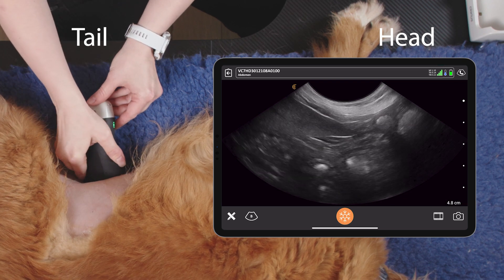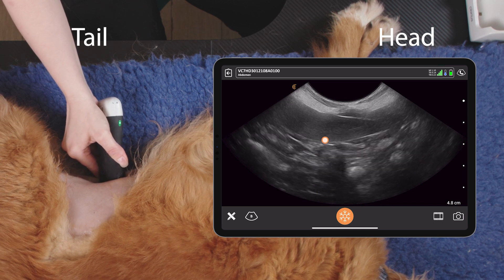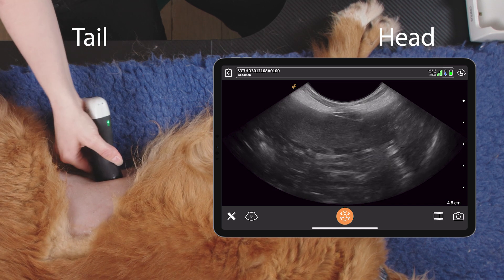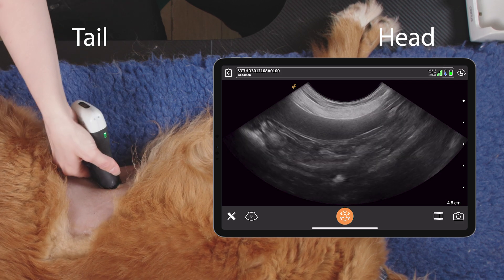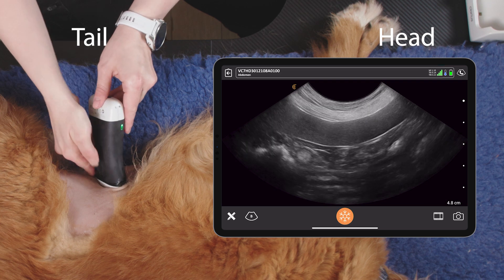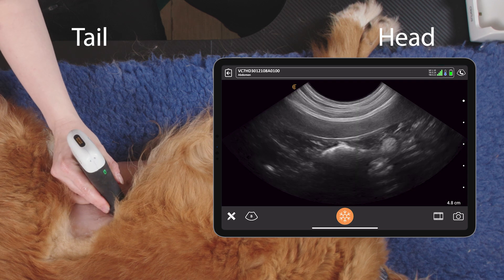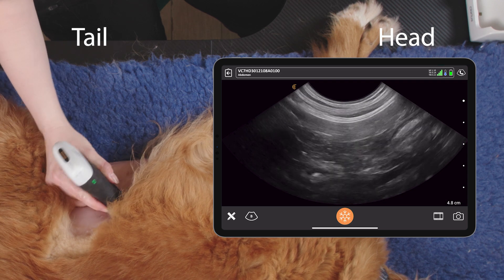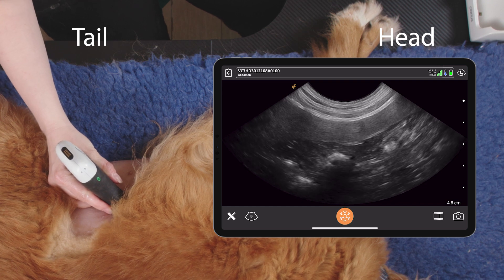When we get there, we want to rotate the probe so we get a longitudinal view of the spleen, and we fan through that section, slide up a section, fan through, slide up again, continuing this pattern until we reach the ribs — the costal arch.